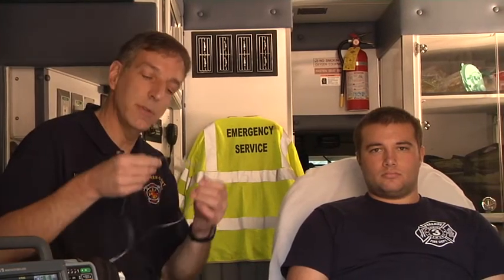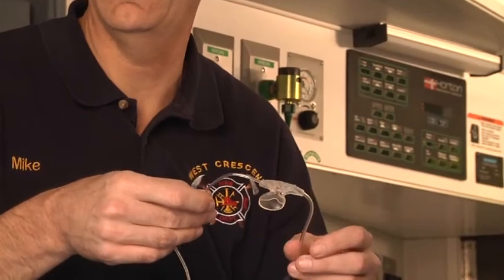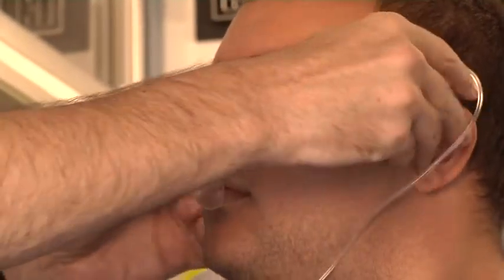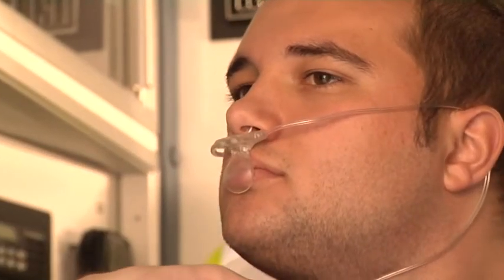We're going to use a nasal cannula type device that's designed to trap exhaled air and to measure the end tidal or exhaled carbon dioxide from the patient. It has a normal nasal cannula that sits in the nose, loops around the ears, and this particular device also has a little mouthpiece that comes down and captures air that's exhaled out of the mouth. Now that the device is on the patient, we'll attach it to the monitor.